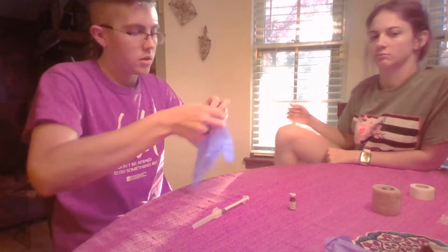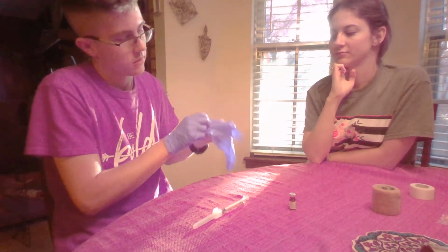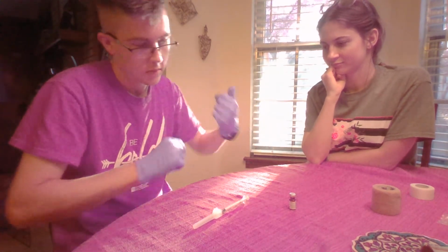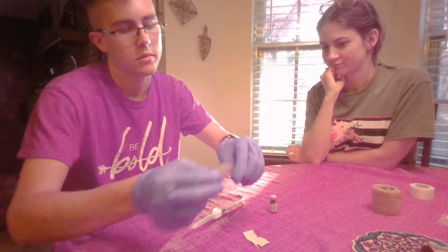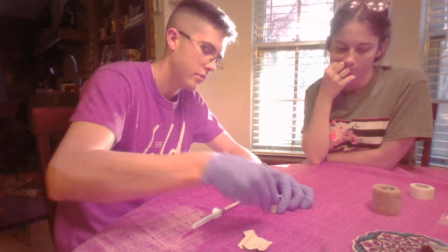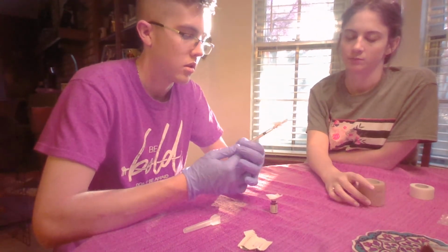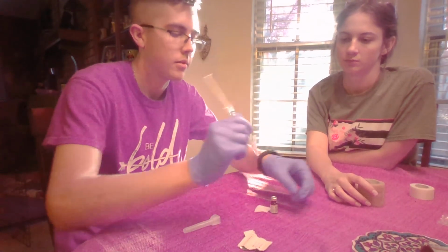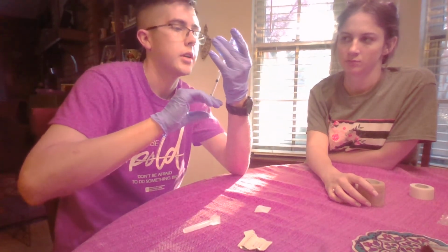Next I will put on gloves. Inspect my medication one more time. It's the correct one. Clean the top of it. Going to fill up 1 milliliter of air. Inject it into my vial.